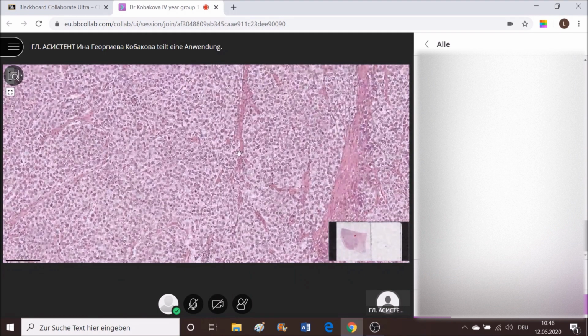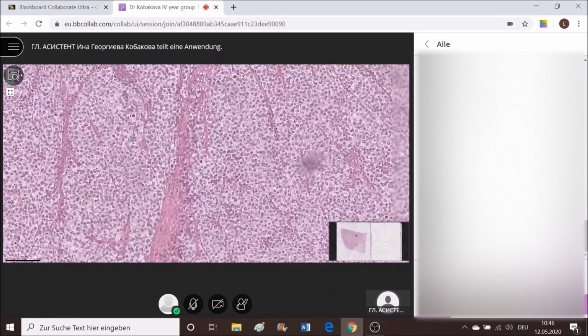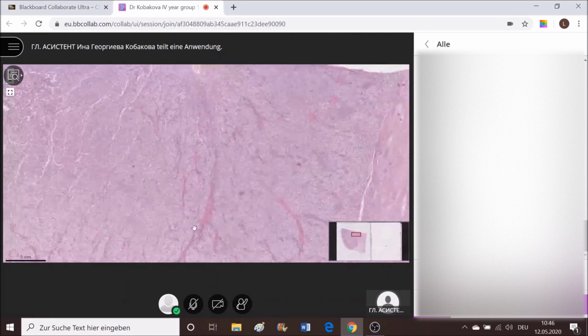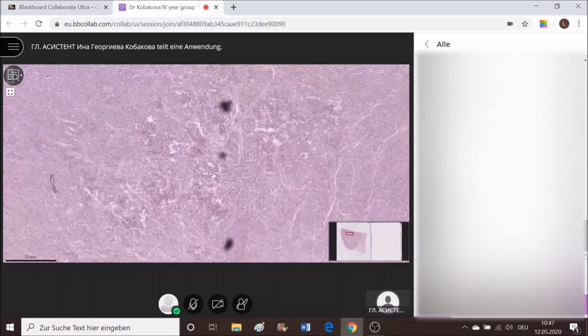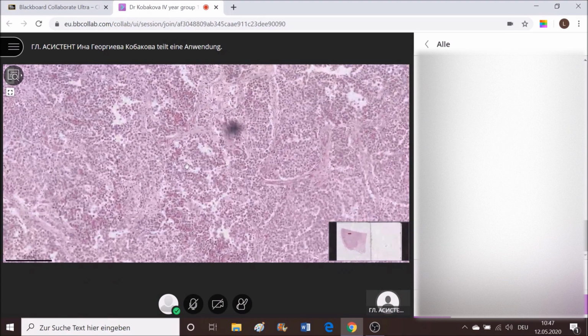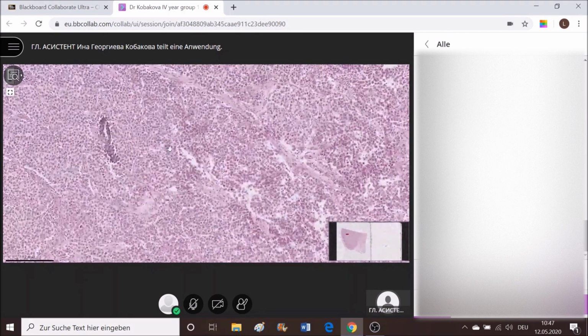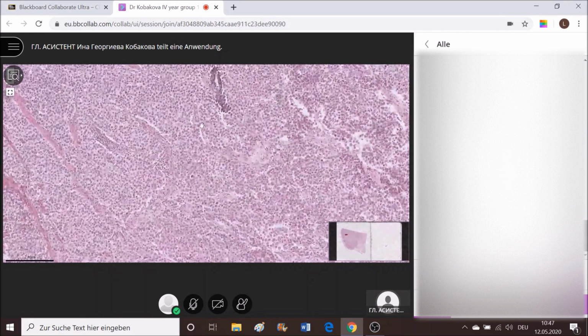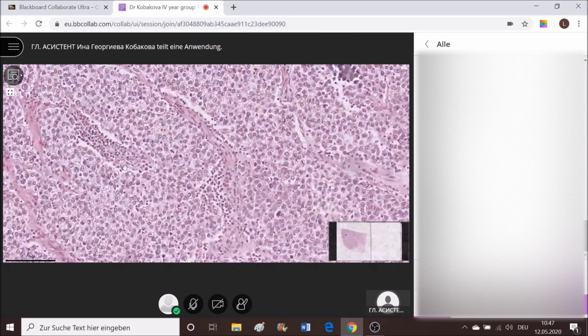The stroma is not much, and pay attention on the idea that the population of tumor cells is mixed with inflammatory cells. Very often, we may observe mature, small, activated lymphocytes, there you go, which are mixed with the population of tumor cells.